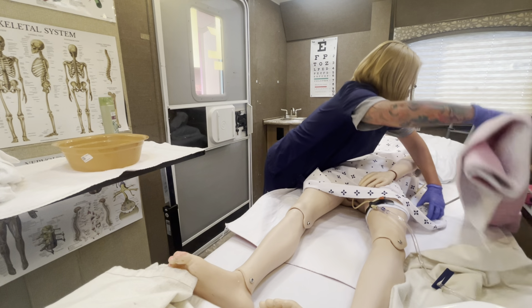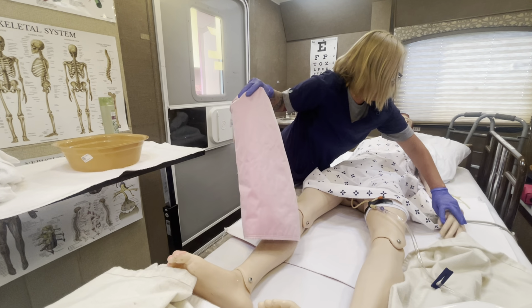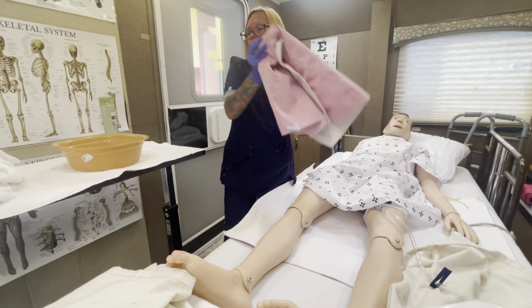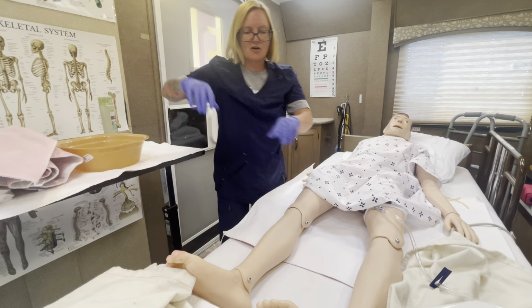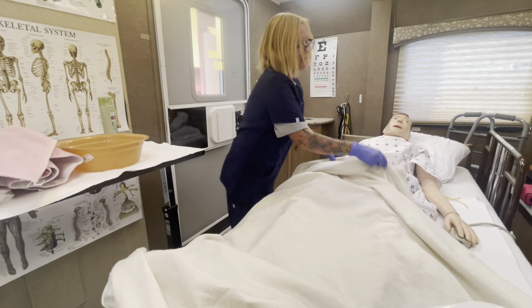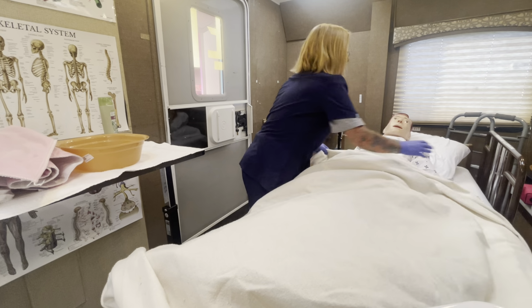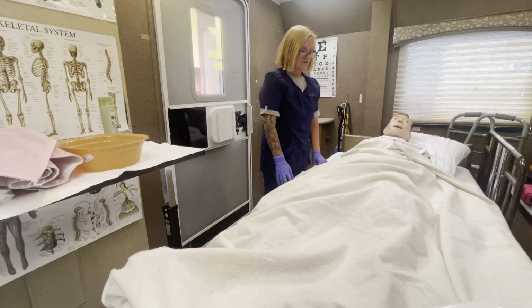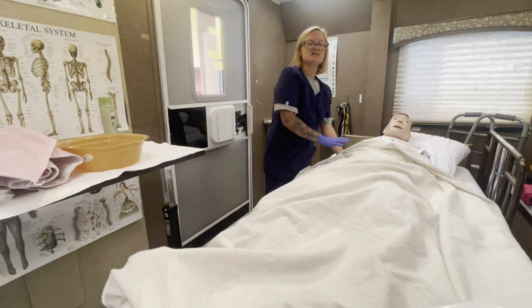I'll make sure that I put the call light back in the patient's hand while it's here. Okay. And then now I can put this on my towel as well. That's all my dirty stuff. I'm going to put his blanket back on where it was. I'm going to check the bed to make sure that it is locked and at a safe level for the patient, and it's in the lowest position.